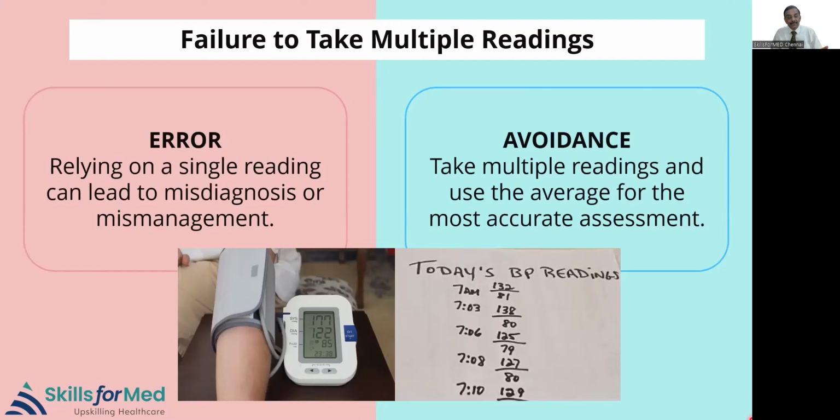Inform the patient how to do the measurement. I know the cardiologist whom I visit gives an A4-page instruction to each and every patient who's hypertensive, giving clear instructions on how to take the blood pressure measurement. So such detailed education should be given.